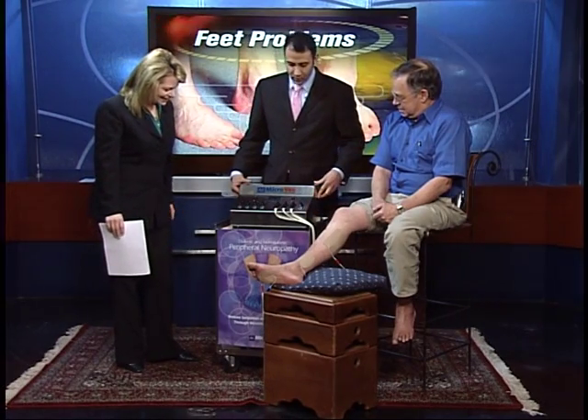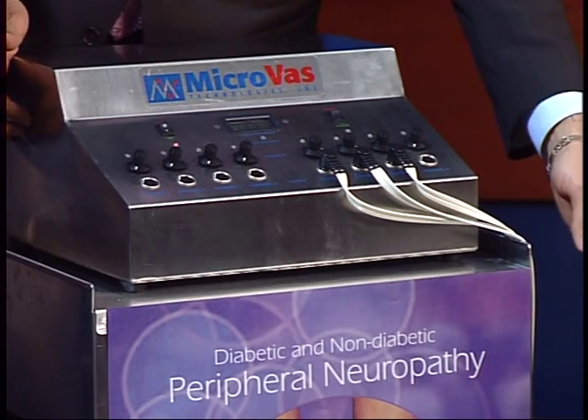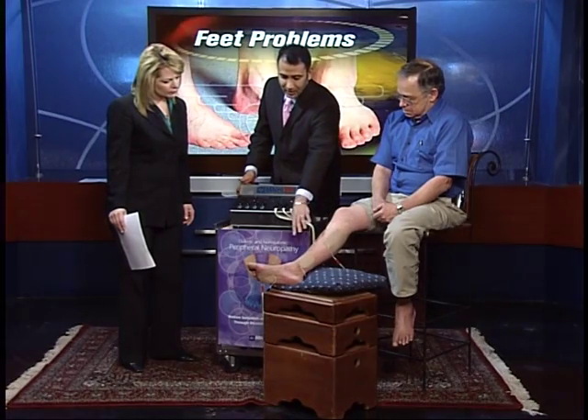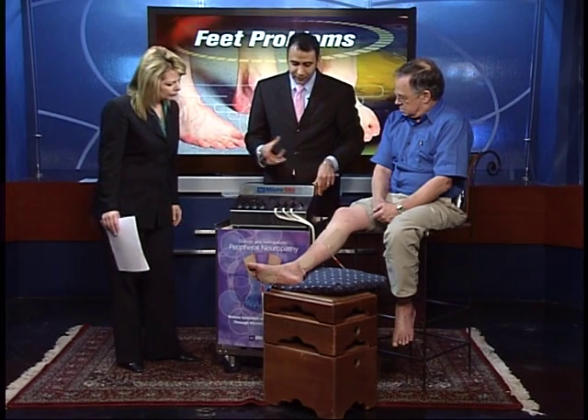Basically the way the machine works is it allows for electric stimulation to the patient's muscles. This is a biphasic system — a patented system which allows electric current to go through these pads. We usually have them up on the thighs, the calf, ankle, and the foot. It allows for muscle contraction.